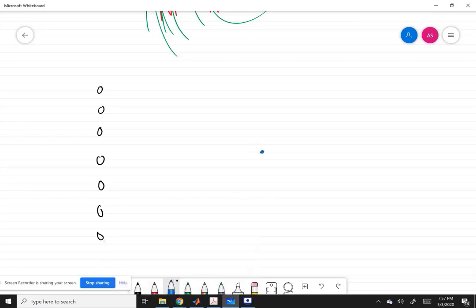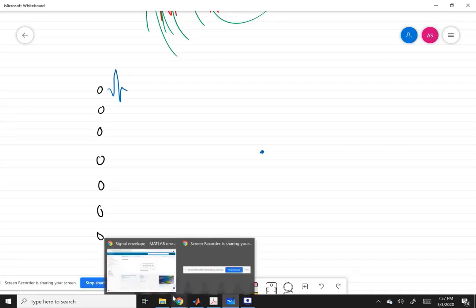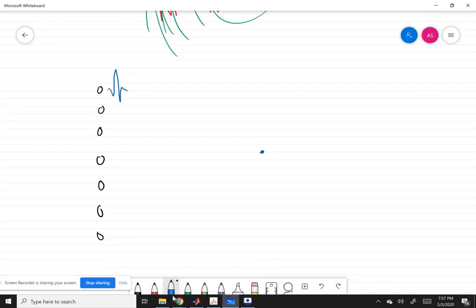Now after the object has been hit by ultrasound, the object itself becomes a spherical radiator. Suppose each of these transducers had an impulse response which is like this. Then all of these, in the far field, would travel and hit this point, and after that this point will start reflecting a very closely related shape, which is also a Gaussian modulated sine wave, and it will radiate it as a spherical wave.